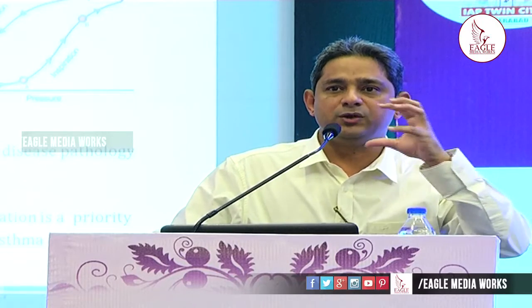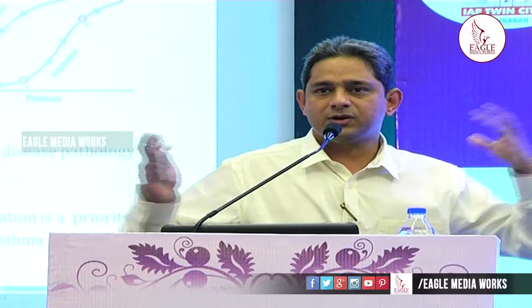Once the alveoli are open, it's just like at the start of blowing a balloon, it will be difficult, but once you blow the balloon to some volume, you can easily blow it. So the same thing. The lower red dot is your lower inflection point. Your PEEP should be just above the lower inflection point. The upper red dot is your upper inflection point. Beyond that, if you increase the pressure, you are going to cause over distension, and your ventilator induced lung injury or volume trauma will be more. So your PIP should be a little bit lower than the upper dot, which is the upper inflection point.